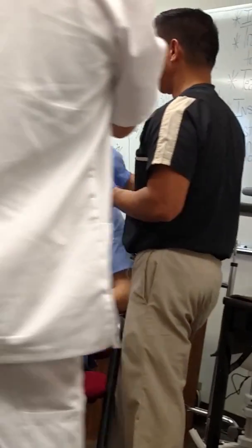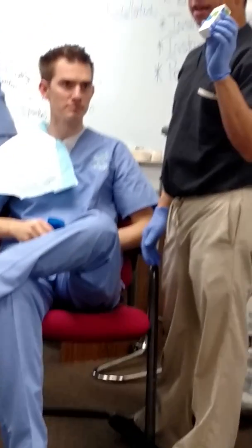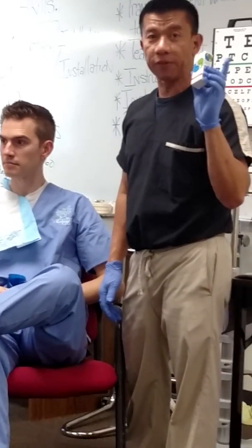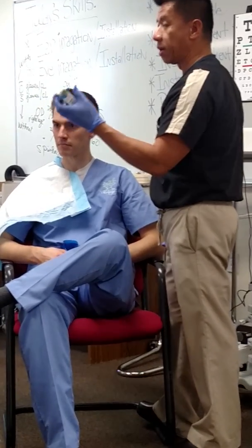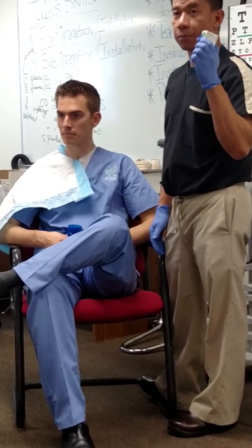All right. Now we have to irrigate. Make sure that you understand the proper medication. Check for the medication. The right medication is not what? It is not expired, and it is the right medication for the right patient per doctor's order.